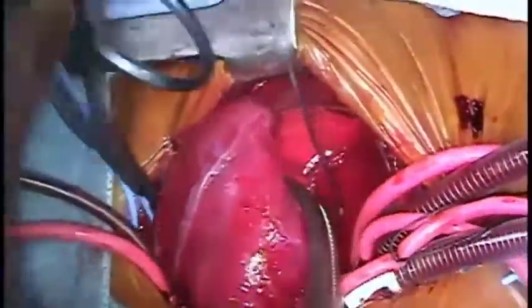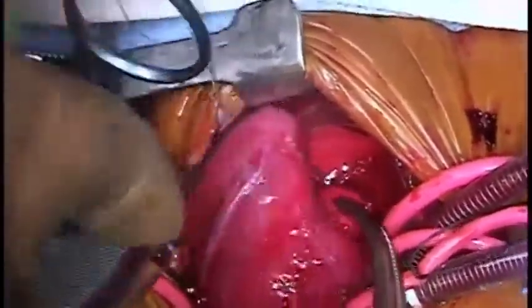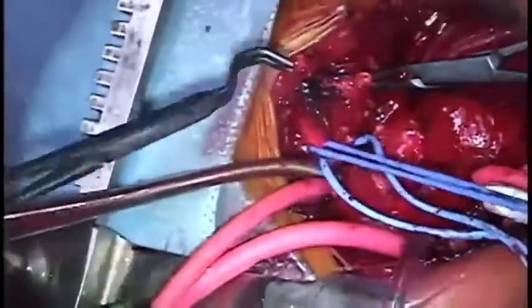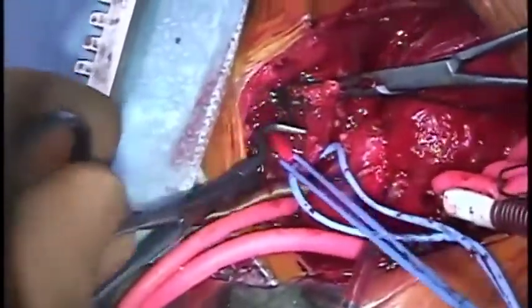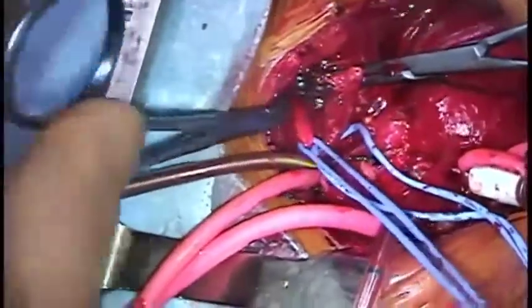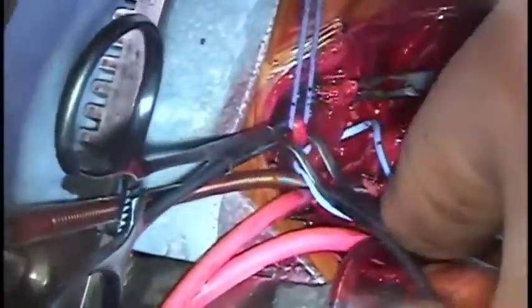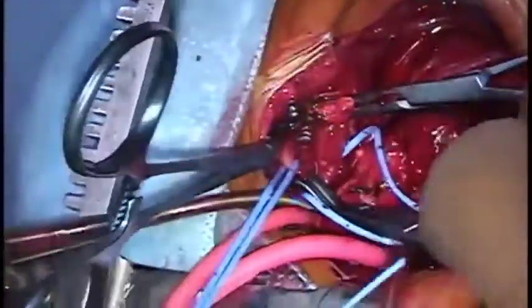The heart is elevated to inspect the perfusion of its posterior aspect. The absorbable ligature on the left atrial appendage is placed back to the left side of the heart in order to prevent it bowstringing any of the coronary arteries. The patient is rewarmed and the left subclavian artery is anastomosed to the left carotid.